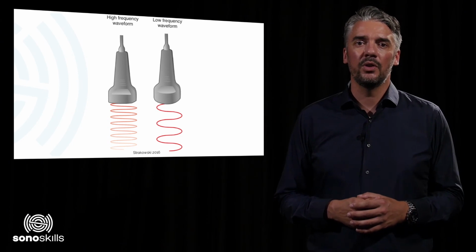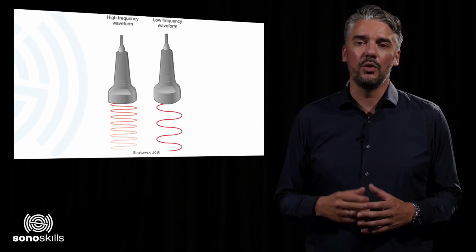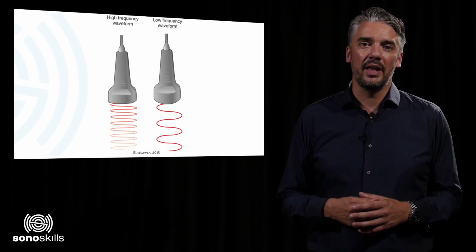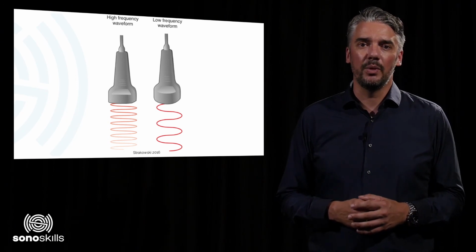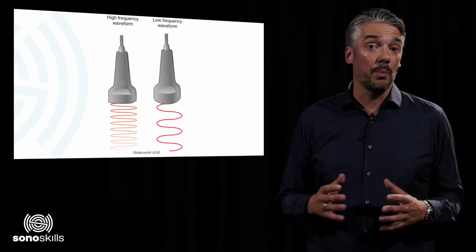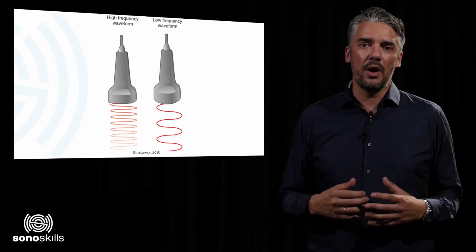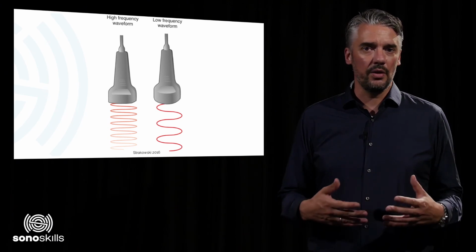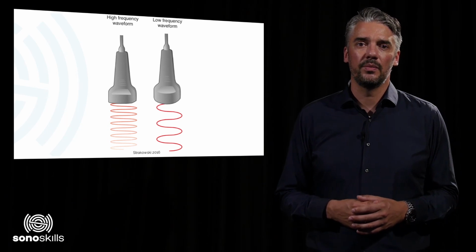High-frequency ultrasound waves, or short wavelengths, generate images of high resolution. Increasing the number of waves of compression and rarefaction for a given distance can more accurately discriminate between two separate structures along the axial plane of wave propagation. However, high-frequency waves are more attenuated than lower-frequency waves for a given distance. Thus, they are suitable for imaging mainly superficial structures.